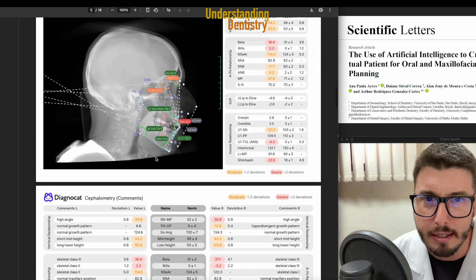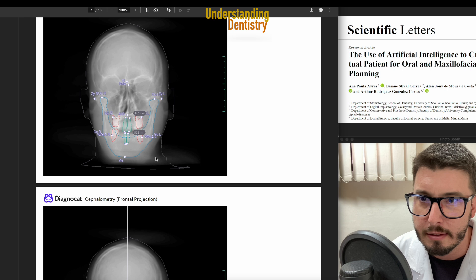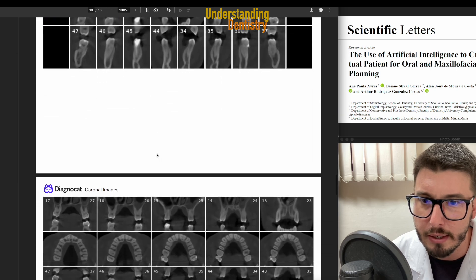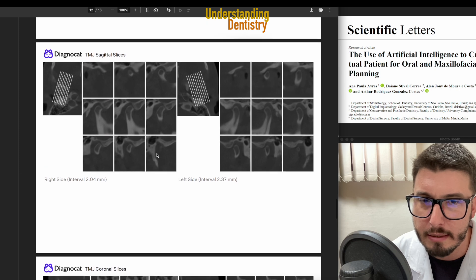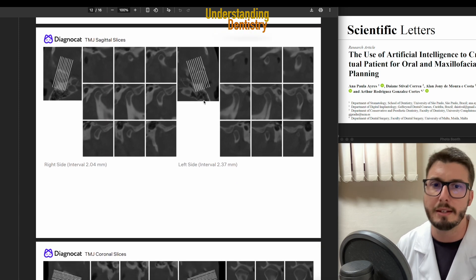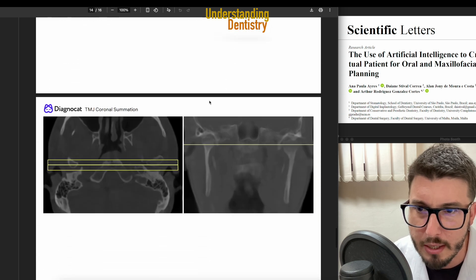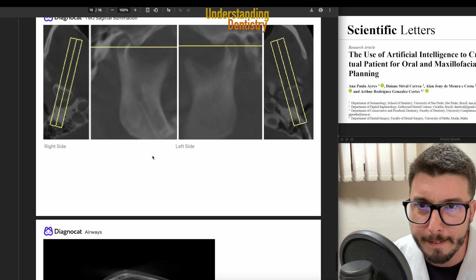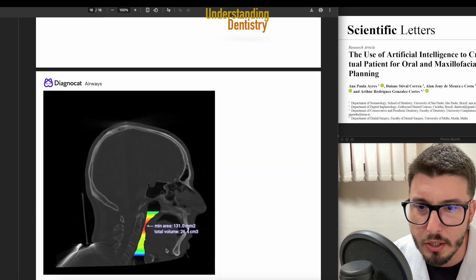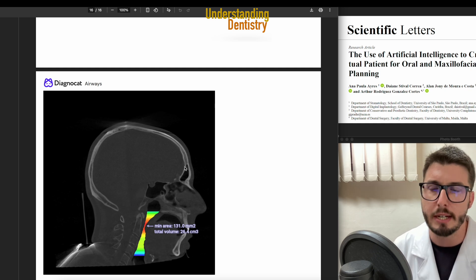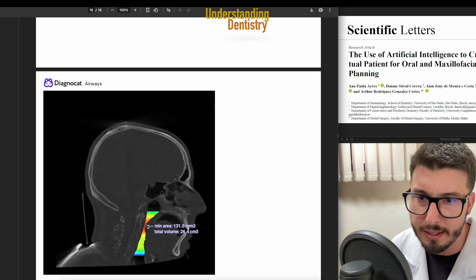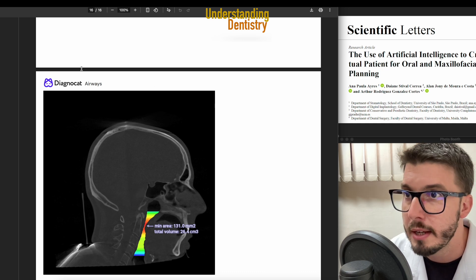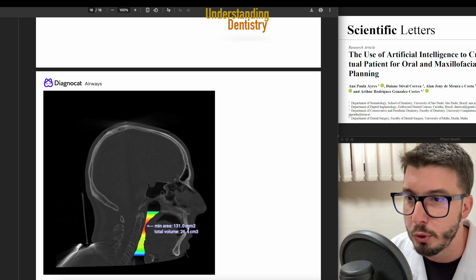This is the orthodontic report of the software, and we have even automated cephalometric measurements. Look how nice — measurements on anterior-posterior radiographs, frontal projection, then the slices, TMJ analysis, sagittal slices of the TMJ. We can assess in every single slice the position of the TMJ considering the slice thickness. Mastoid cells, TMJ — very nice TMJ segmentation. Then the airspace — airways are also here. There is a constricted space here, so this may be part of the diagnosis and treatment plan as well. Very nice orthodontic automated report by AI.